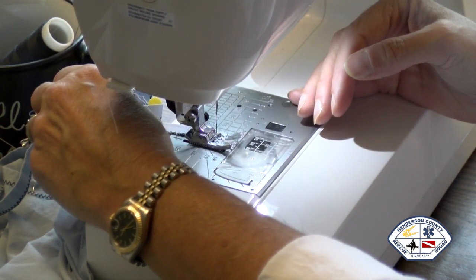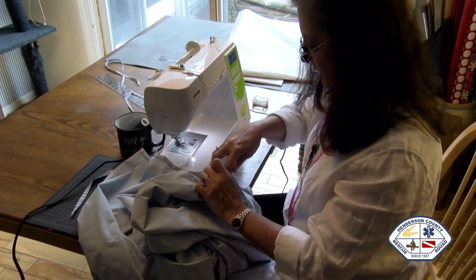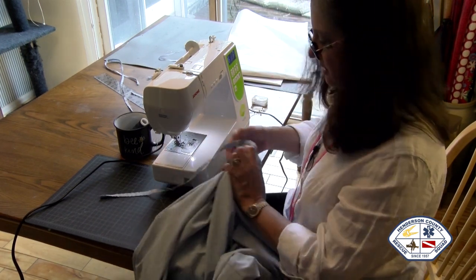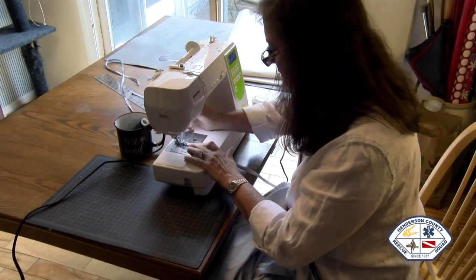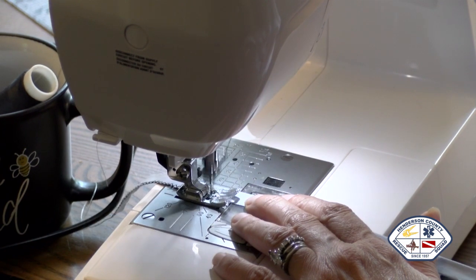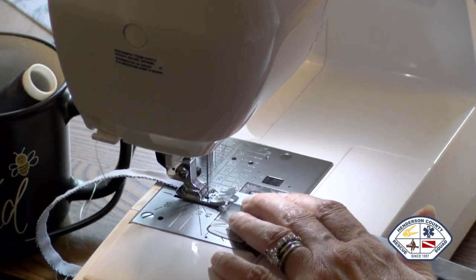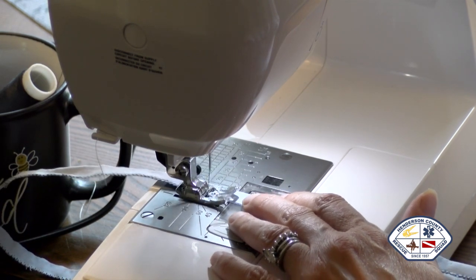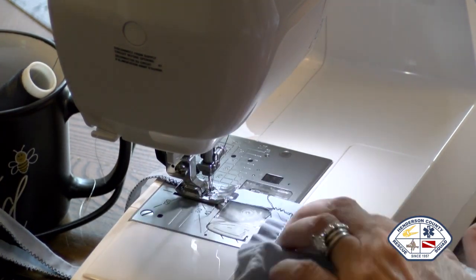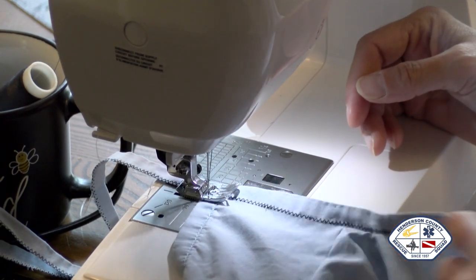All right, here comes my favorite part. Listen for the snip. And snip. And that will give me a nice pretty edge on my ties. Let's go ahead and just zip this thing through real quick. Doesn't take long, but I did make my stitch for this necktie part just a smidgen wider. All right. Perfect.